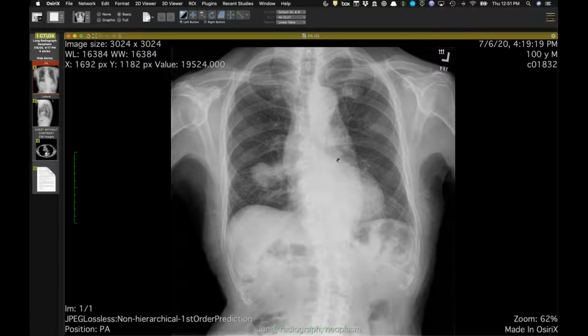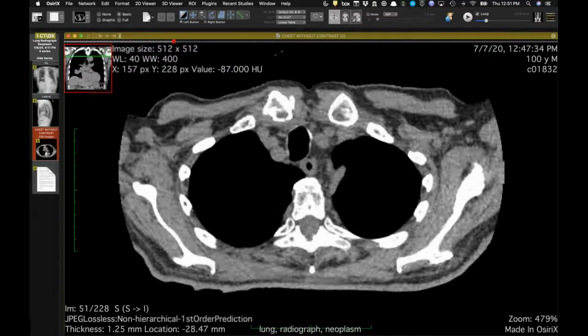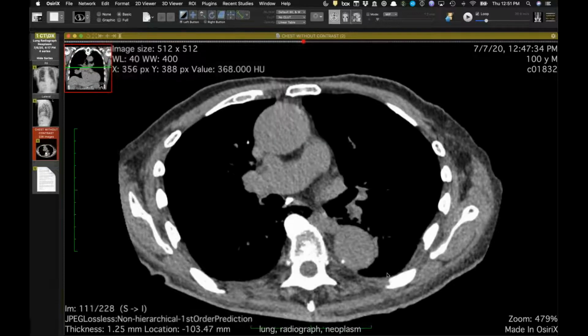So that confirms that this is cancer, and right there, that's the finding right there, that you can stage him as at least M1B disease, since he's got at least one bone metastasis. And so occasionally, we'll see that when you see something you suspect is a cancer, look for the other lesion. You can see it's in the right middle lobe here, and you might think pneumonia, but then you add the rib lesion in, and you've got your answer. And there is the permeative destructive lesion of that left posterior rib.